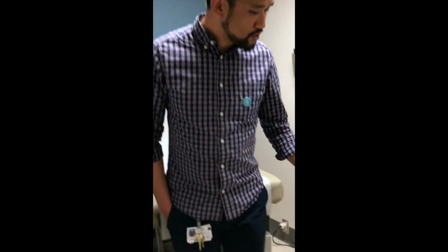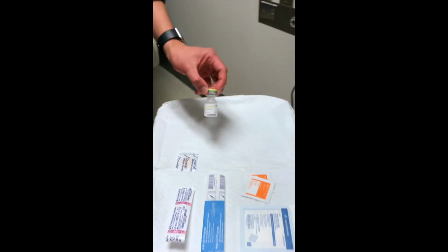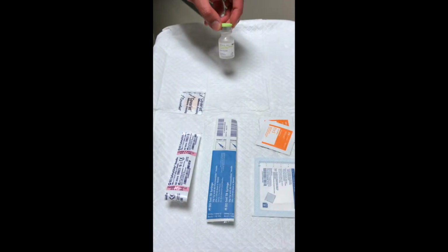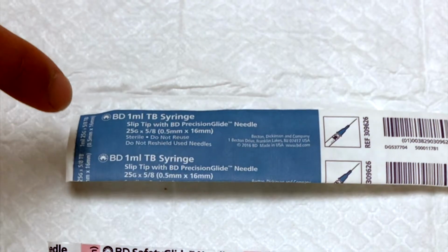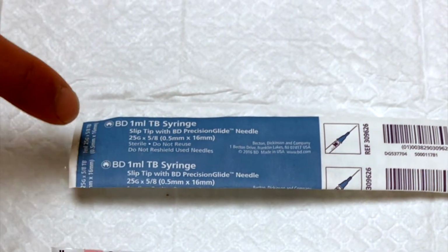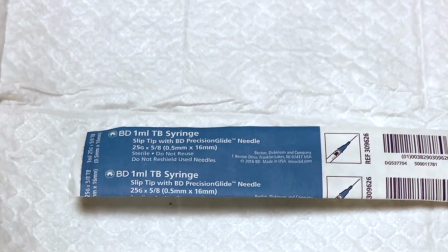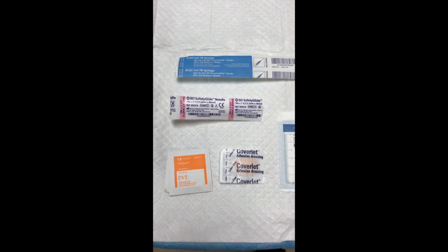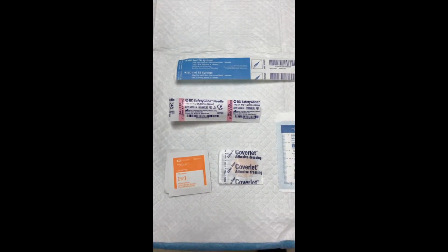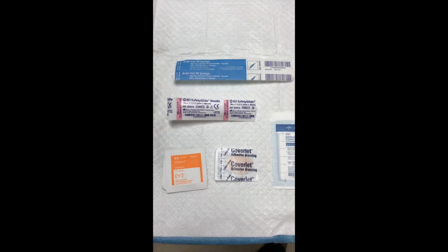So what we're going to use today is a vial of normal saline, which we will use as a substitute for testosterone or estradiol. The supplies you'll be getting from the Kaiser Pharmacy are usually a 1 ml 25 gauge syringe, which is usually blue in color, and an 18 gauge needle, which is usually pink in color. Now, if you're administering estradiol, you might get a larger syringe, just as an FYI.